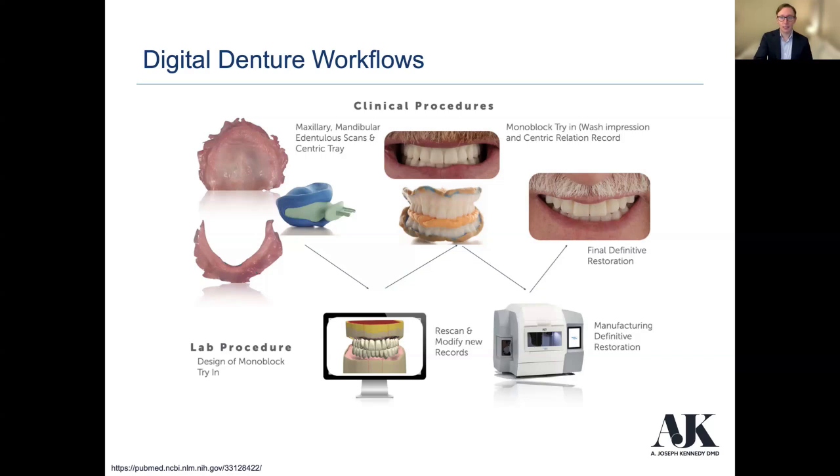This is a monolithic resin. You just look at it right in the middle there. It's just white. Doesn't need to really look great. This is kind of the wax try-in phase, right? Does this look good? Sure.